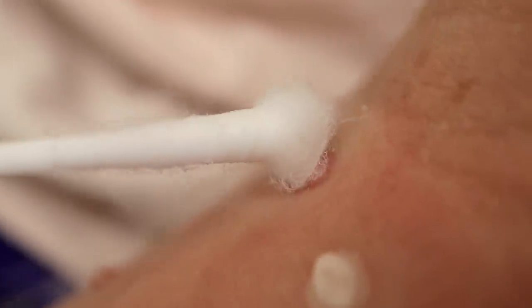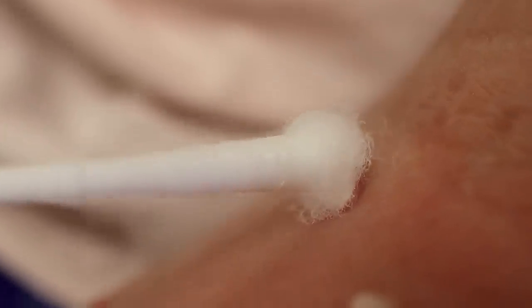A little bit of normal tissue frozen. So you probably feel that a little bit? That makes sense. Too bad you couldn't do this for this nice hair. Oh, that would've been cool. You're doing awesome.